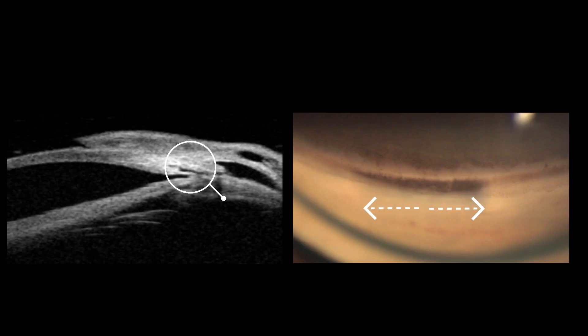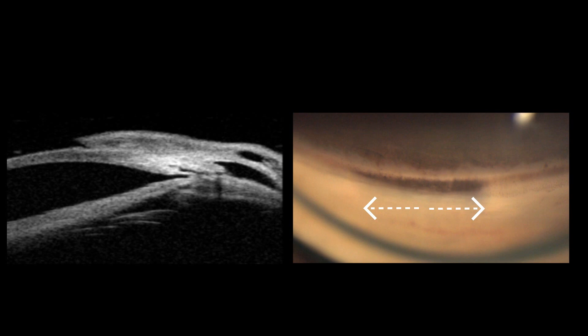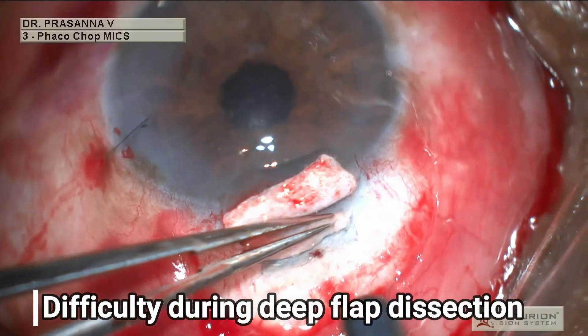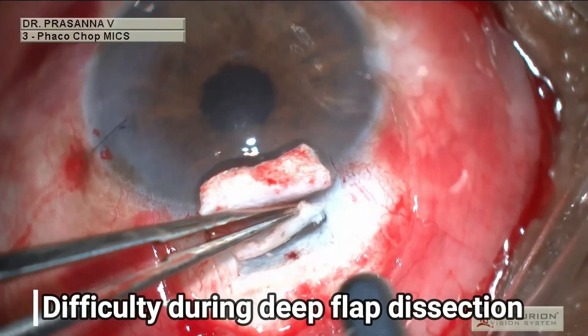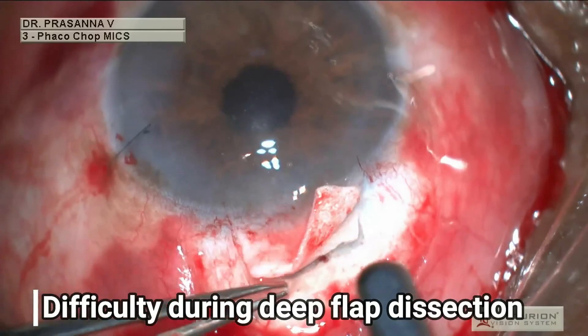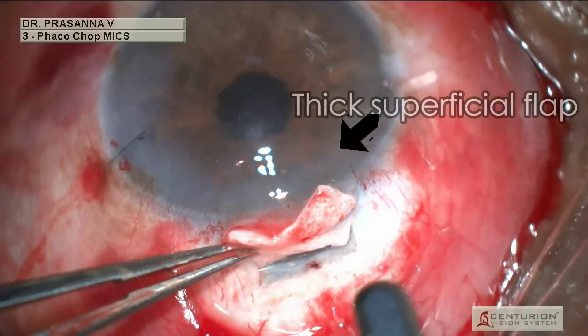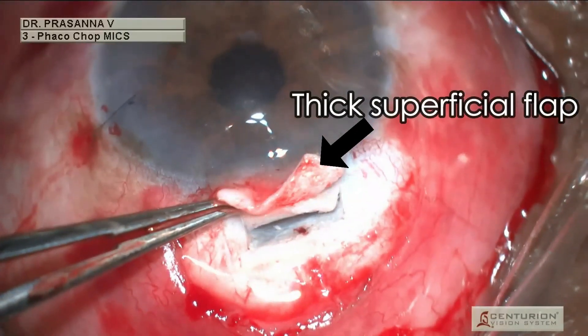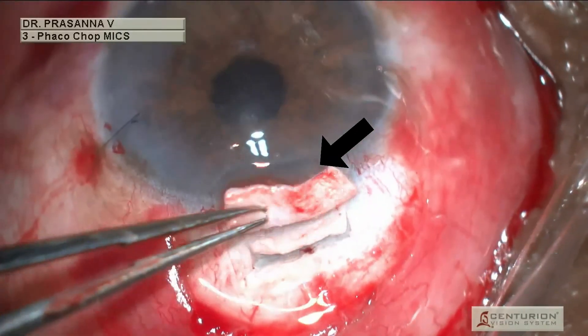NPDS has a steep learning curve. Don't worry — we will guide you through the management of common complications. This clip shows the difficulty faced due to a thick superficial flap; one has to avoid this.